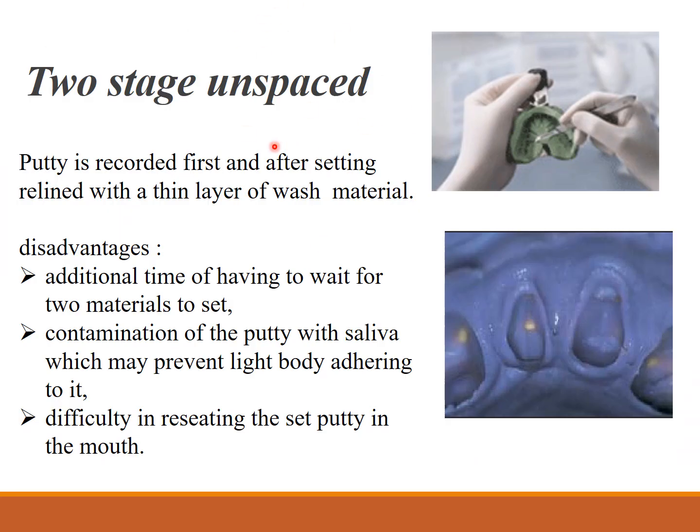Two-stage unspaced: putty is recorded first, after setting relined with a thin layer of wash material. Disadvantages are the additional time of having to wait for two materials to set, contamination of the putty with saliva, yes, that is there, and difficulty to reseat it back in the mouth.